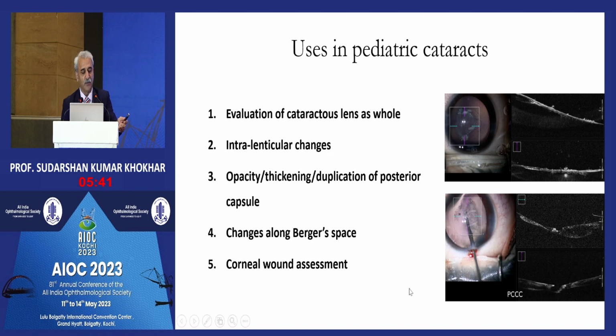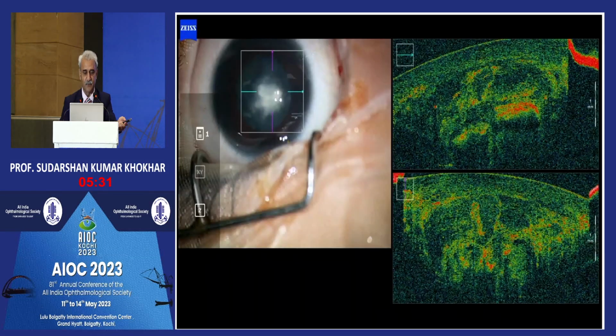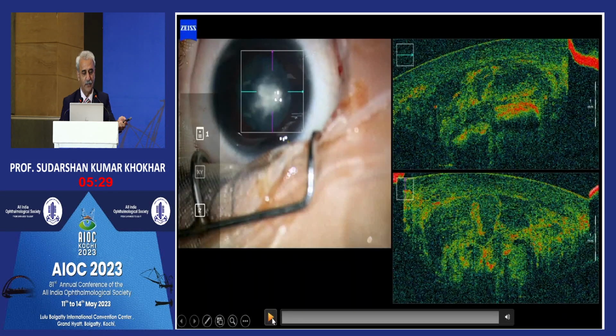You can work around the Berger's space. I'll show you some videos about the Berger's space, how you can actually define it and find out how it's opening. And Mary Sessegan is doing lots of work on the Berger's space. And of course, the wound construction can be seen. Okay, so this is video number one in which you can actually see the cataract.